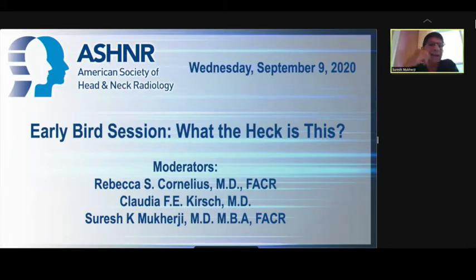One thing that I wanted to ask, and maybe in the chat box as well, is sometimes we do see lipomas, not necessarily in the visceral space, but involving the soft tissues, the subcutaneous tissues of the neck. And we sort of know it's a lipoma, but we see a little bit of stranding. So for instance, if this case was an earlier case, if we saw it earlier and it was smaller, I think the challenge is what do we do about follow-ups?